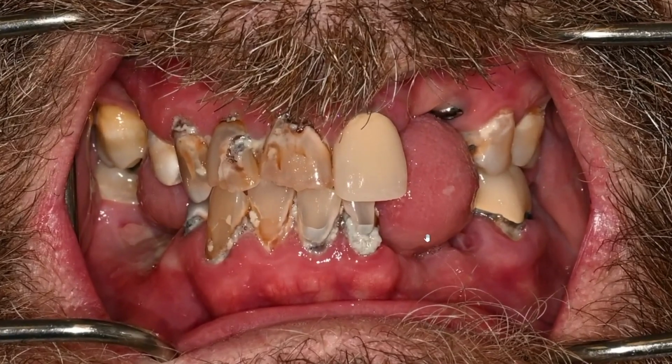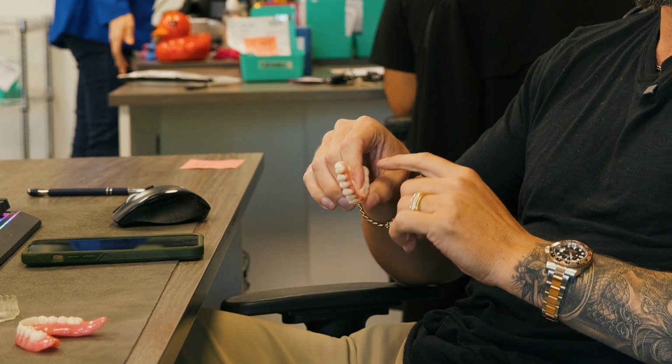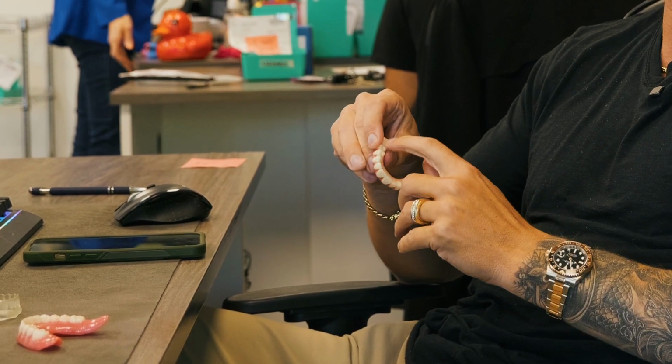The upper teeth are gonna come out, bone reduction is gonna happen. We're basically gonna have him level off that bone to the height of the existing platforms of the current implants. So when everything's level here, as you can picture these teeth coming out, leveling off, placing a couple more implants in the anterior, maybe 1, 2, 3, and then maybe a 4th implant right over the molar section.